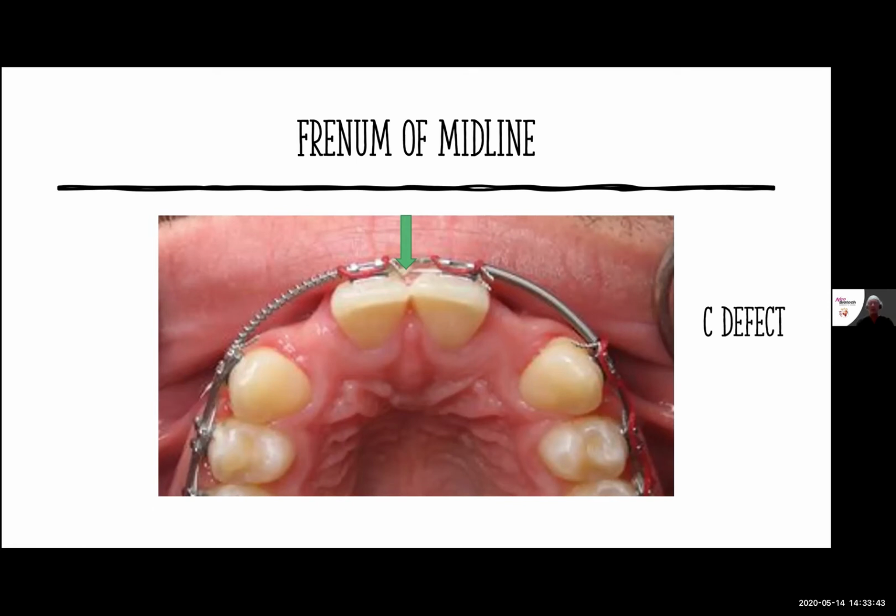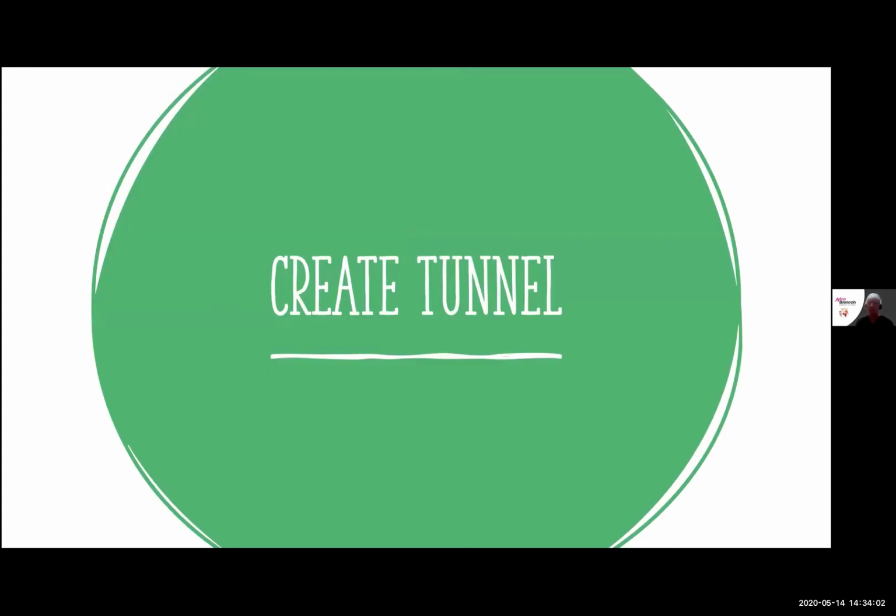Oftentimes, I would like to place my implants just at the final steps of my actual orthodontics, in order to remove my orthodontics, make the crowns and retainers and everything at the same time. And so midline is where I'm going to make my initial incision in a cosmetic area.